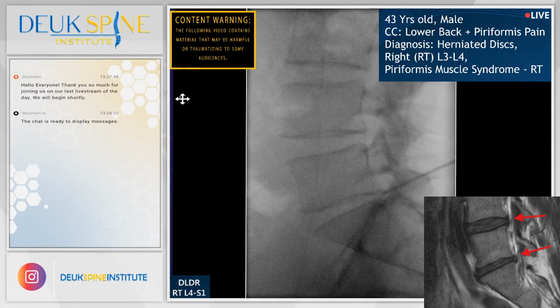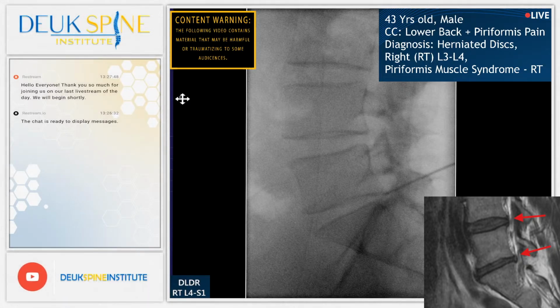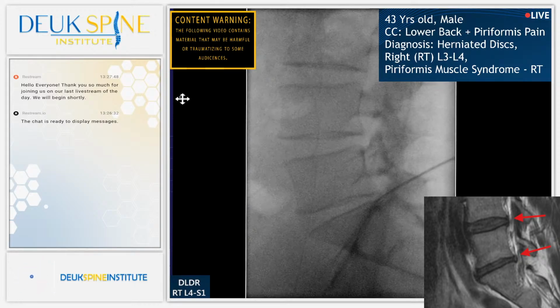All right, we're getting into the L5S1 disc first shot. Let's see what's going on here. We're kind of stuck on something. He's got a pretty collapsed disc, but it is bony here. I've got to figure out why. I think I'm hitting the bottom of L5. Yes, I was. Now I'm heading into the disc. Shot, still very collapsed.